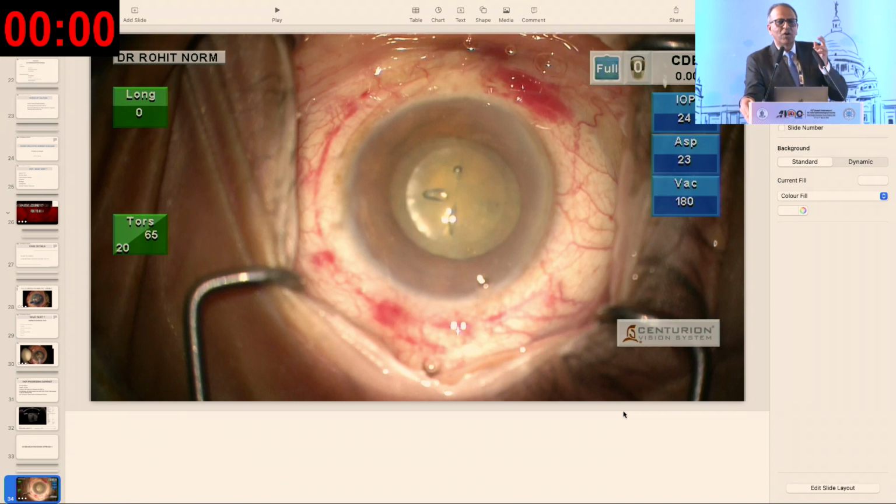There are cases where you suddenly say that you started with phaco and suddenly the nucleus went behind and there is no fault of mine. Well, the idea is that at times there is a PCR with high fluidics, with high gushing of fluid, and the nucleus falls behind. Low fluidics, aptly used, can save your day. Thank you very much for your kind attention.